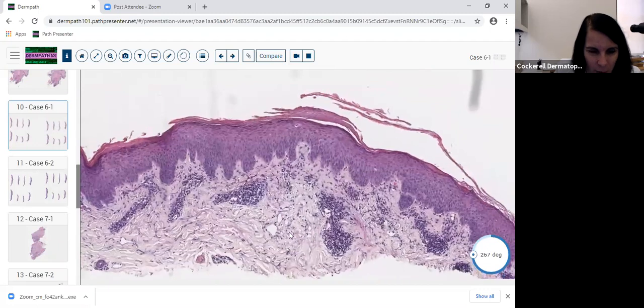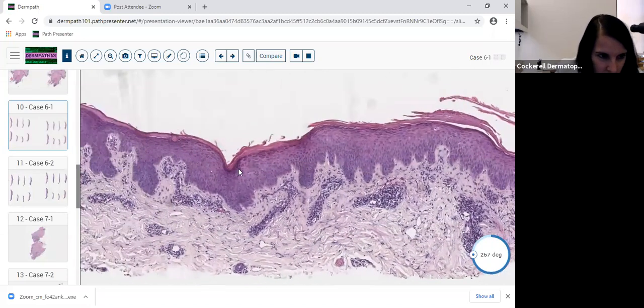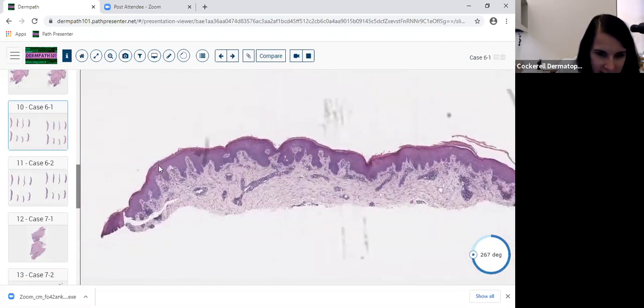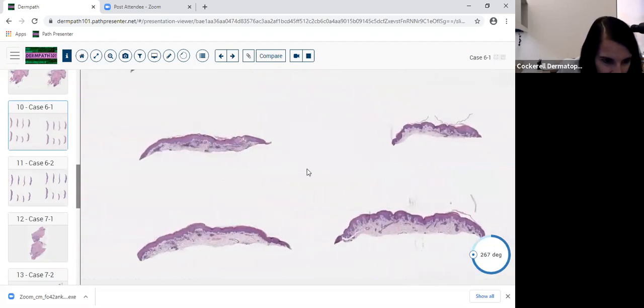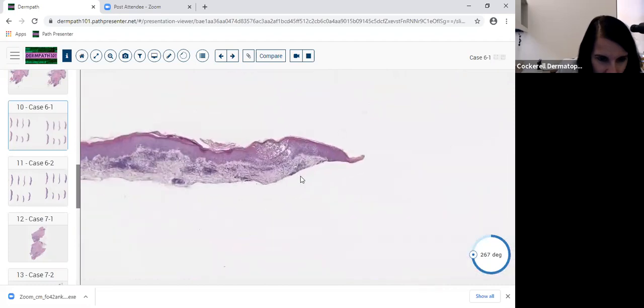Well, I don't see hypogranulosis, and there's not thinning of the suprapapillary plates. And I'm not seeing neutrophils in the stratum corneum, but wait, let me look around some more. I'm only looking at this one piece. Be sure when you're on the test to look at all the pieces as quickly as you can. You know, on low power, scoot around and say, hey, wait a minute, what's that? What is that? I definitely want to home in on this.